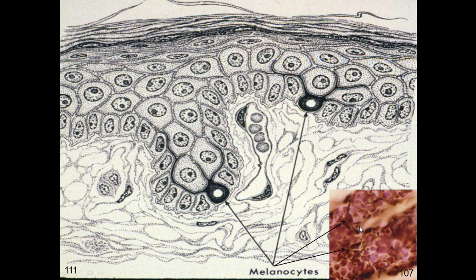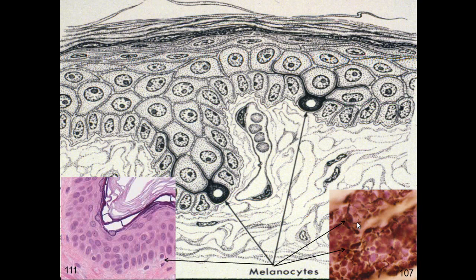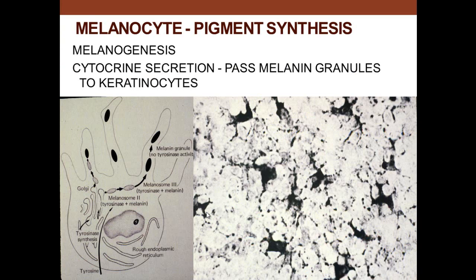If you took the epidermis and looked from the view that the dermis has of the epidermis, you would see these dendritic cells, these melanocytes, located in through there. And as I mentioned, they are clear cells. You see one here, see one there. It doesn't make desmosomal connections, and so whenever it contracts during the processing, some of the cytoplasm pulled away, and it looks like a clear cell, as we see there in the basal layer.